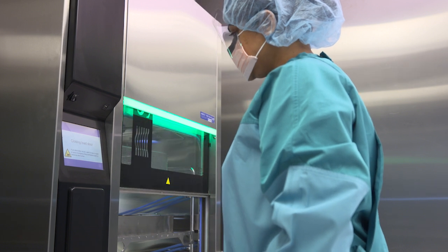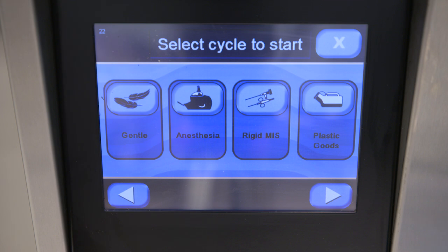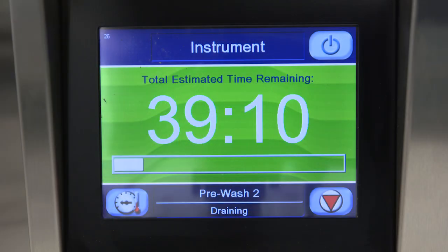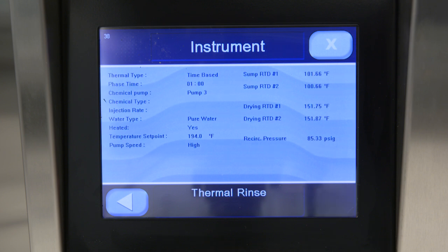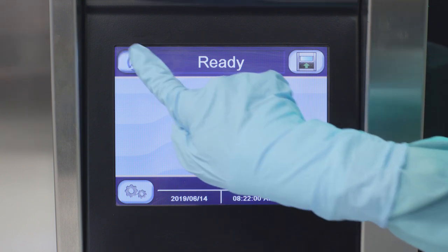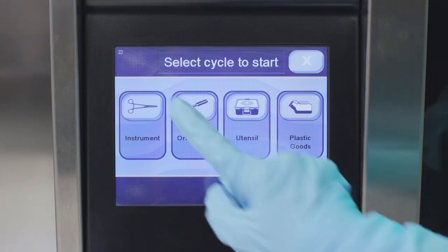Now you can initiate the cycle. Pre-programmed cycles and cycle icons make it easy to start a cycle and track its progress. The screen displays critical information including cycle status, cycle performance, chemical injection, cycle graph, and other critical parameters. To initiate a cycle, select a cycle from ready mode to see pre-programmed options. Select the appropriate cycle for the load type and rack in use, and the washer will start the first phase of that cycle.